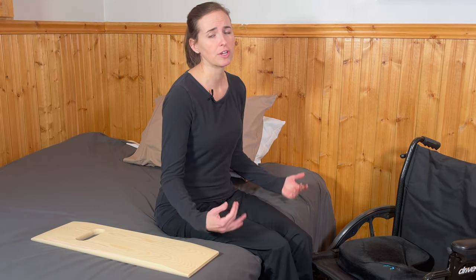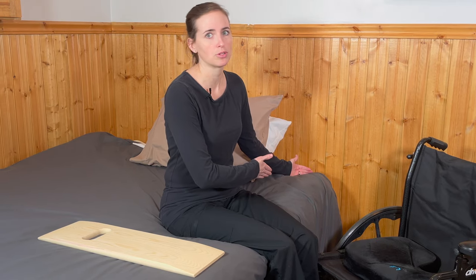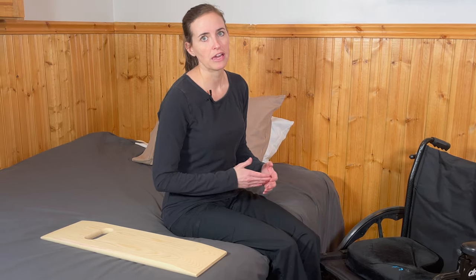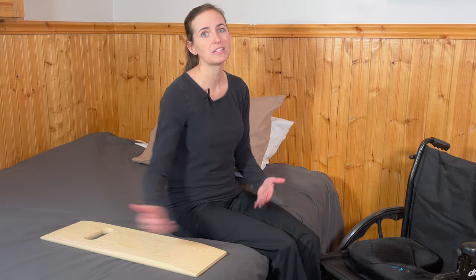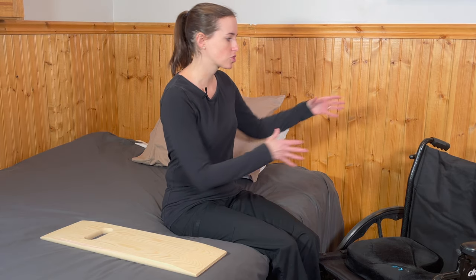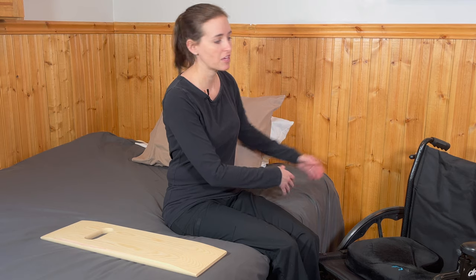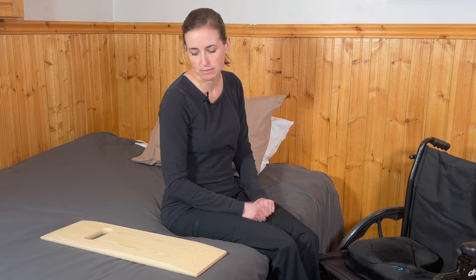It's very important that when you attempt a slideboard transfer, you get yourself positioned as high up in the bed as possible — usually higher than you think — because if you end up too far down, you'll need to scoot up the whole length of the bed to get into position. Make sure your space is set up appropriately; for example, an end table next to the bed may need to be moved so you can position yourself as high up as possible.